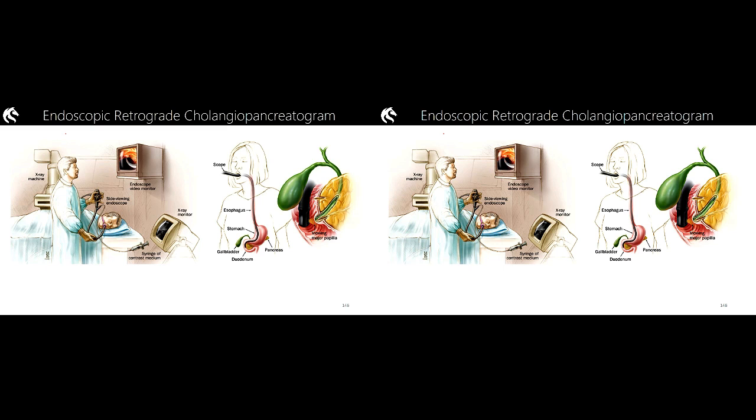Right. An ERCP, or endoscopic retrograde cholangiopancreatogram, is a fairly frequently performed examination. At John Hunter, for example, it's not uncommon for us to do 6 or 8 of these a day. What are they? It's a fluoroscopic examination, and it starts off with the patient in an RPO position. It tends to be about a 15-degree RPO.